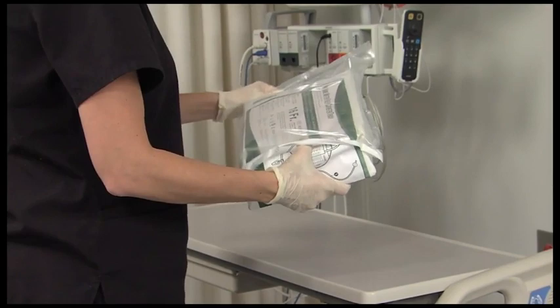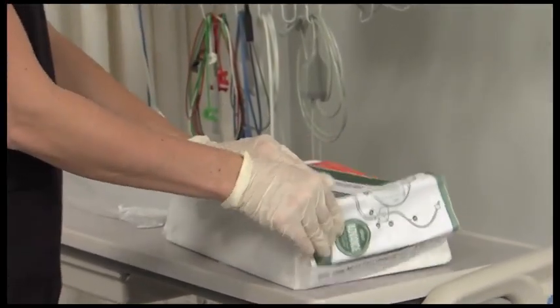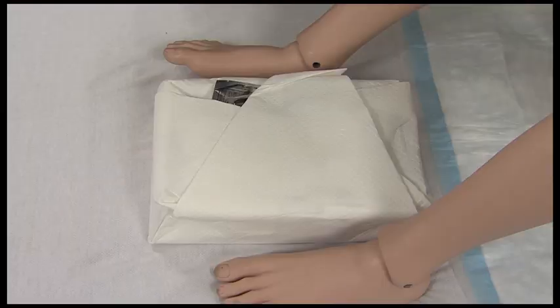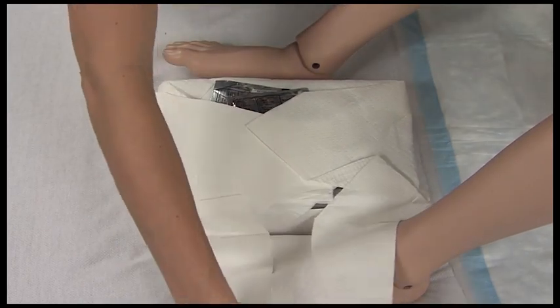Open outer packaging of the Foley catheter tray. Remove the directions for use brochure from the bottom of the tray, label and orange sticker sheet from on top of the tray, and set aside. Place the Foley catheter tray between the patient's legs. Using proper aseptic technique, open outer wrapping, opening the first fold away from you.